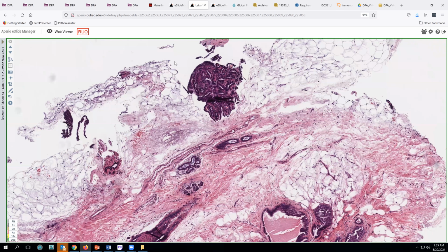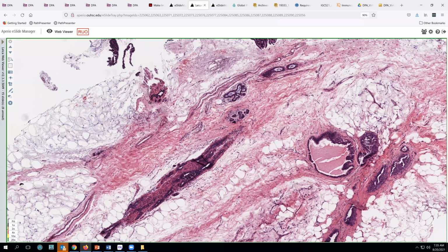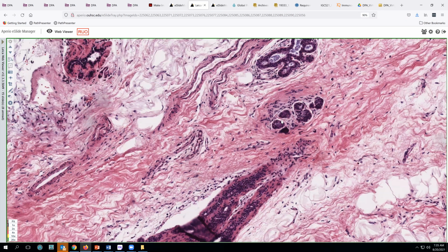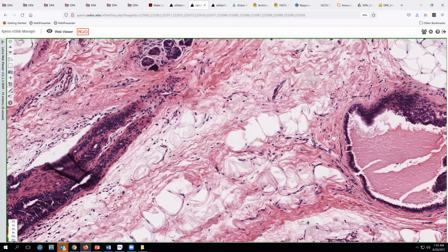But finding a lesion like this in a sample like this will usually lead our surgeons to perform a local excision to excise the lesion and to evaluate more fully the wall and the areas around it. An area like this, we would probably want to go to a higher magnification to make sure this isn't a focus of infiltrating tumor, but it does have a lobular appearance. If we were concerned, we could do a P63 stain and so forth.